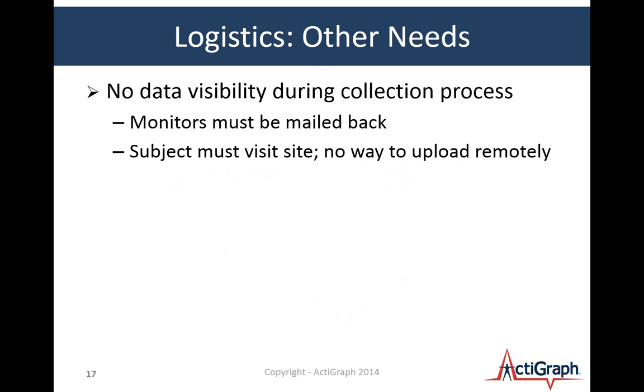And in our case, if you want to see the data that's been collected by our monitor, they have to mail the monitor back, and the subject must visit the site and give that monitor to the site coordinator for them to collect that data. But there's no way for them to upload that data remotely or give any real-time feedback to the clinic or to the CRO or to the pharma company as data collection progresses.